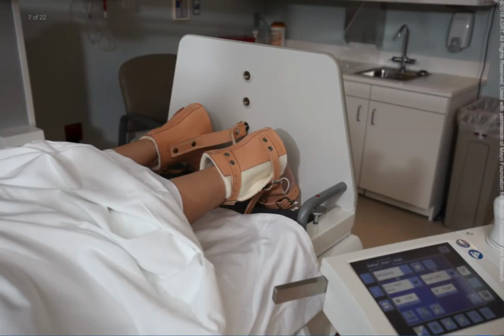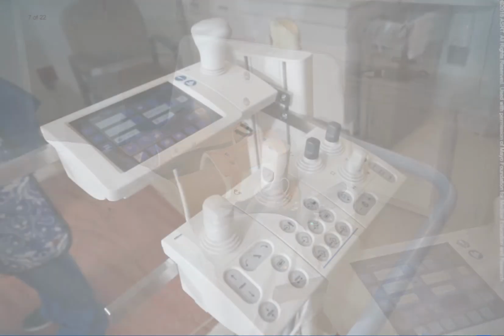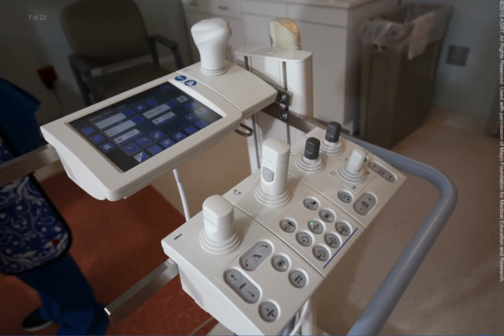To be able to safely tilt the patient during myelography, a tilting fluoroscopy table with proper support devices and physical ankle restraints is necessary. The ability to manipulate the table is key to moving the injected contrast into the correct position for imaging. Pulsed fluoroscopy and last image hold, or LIH, functions are useful in decreasing radiation dose to the patient. Reducing pulsed fluoroscopy to 7.5 pulses per second and reducing filming rate to 1 exposure per second greatly reduces radiation exposure to patients and others in the room.